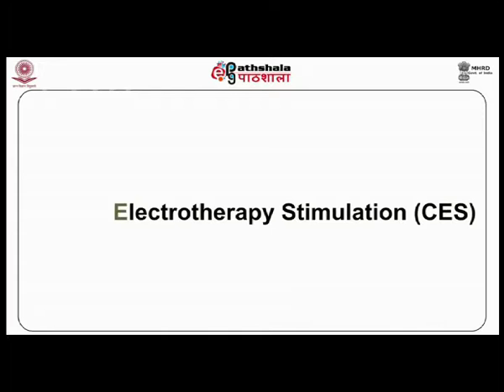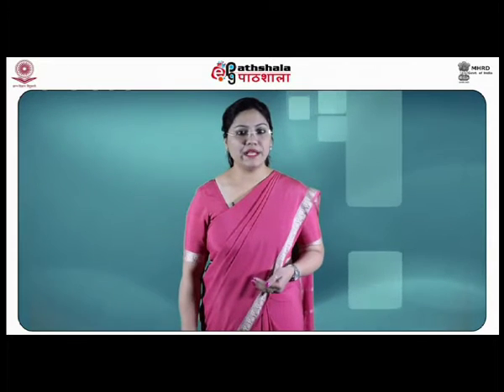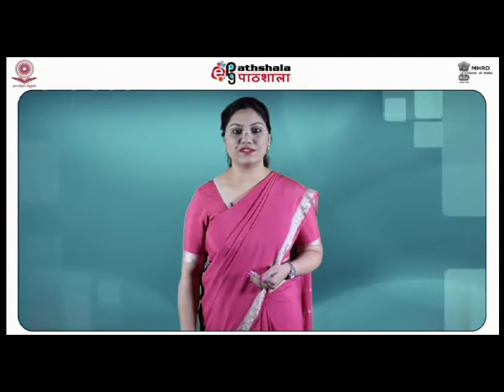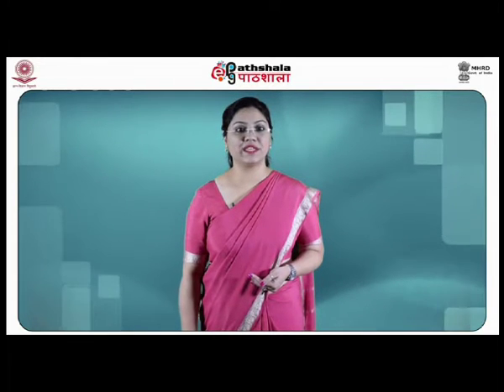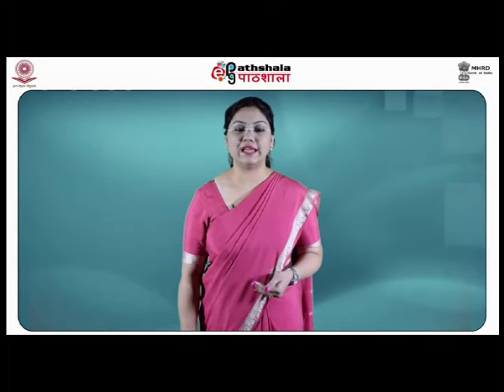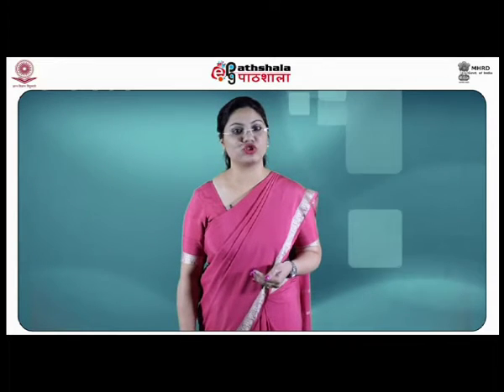Cranial electrotherapy stimulation, CES. Cranial electrotherapy stimulation is a psychiatric treatment in which a small, pulsed electric current is applied across a patient's head. Some researchers and doctors claim that CES has beneficial effects in conditions such as anxiety, depression, insomnia, and stress. The exact mechanism of action of CES is not well understood, but it is assumed that CES reduces the stress that underlies many emotional disorders.